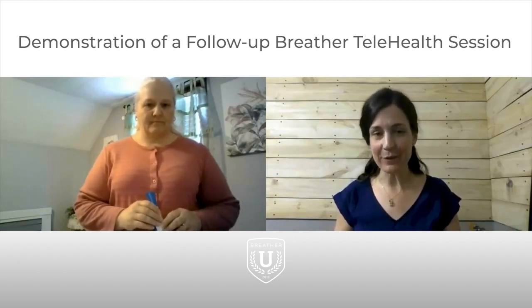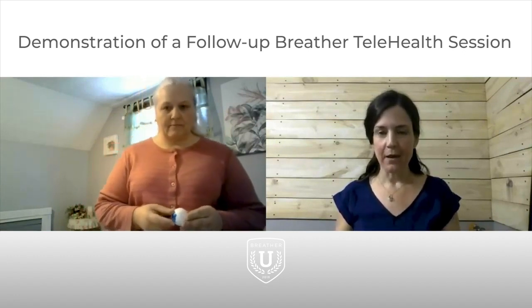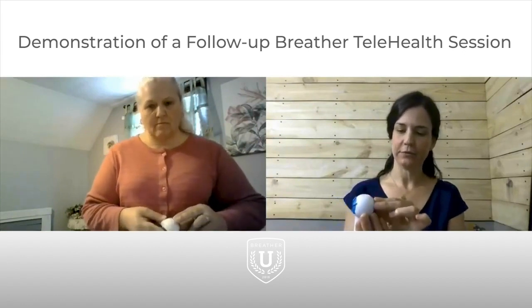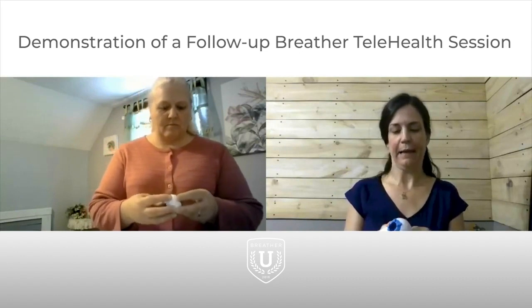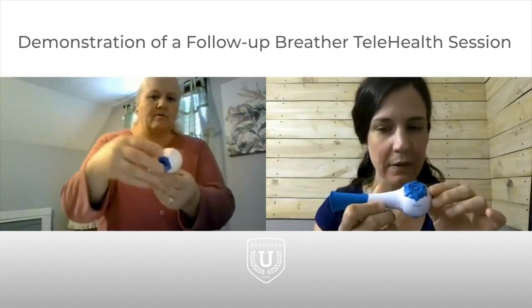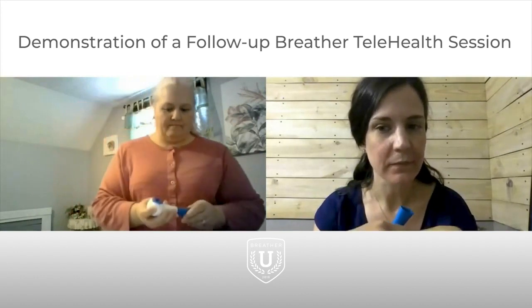I think you might be ready to try to increase the resistance a little. Do you want to try that? Sure. Okay. Let's try doing both. So let's try to move inhale to 3 and exhale to 2. Can you see? Inhale on 3. Yep. Exhale until perfect. Good. Good.